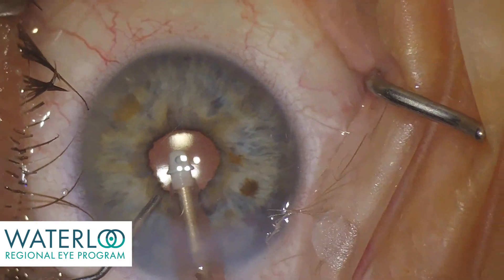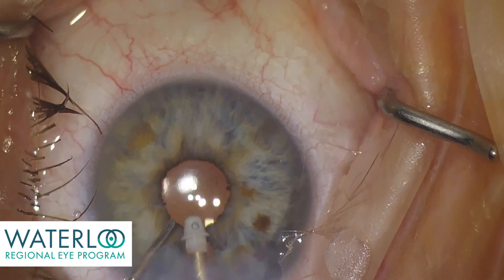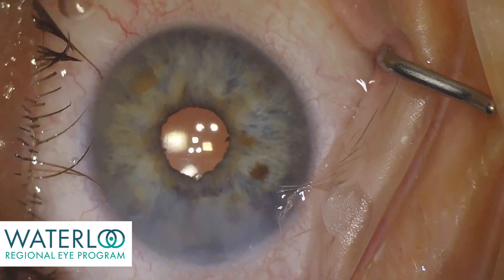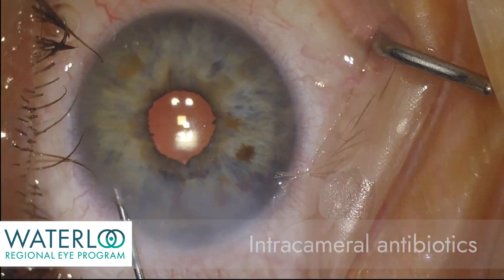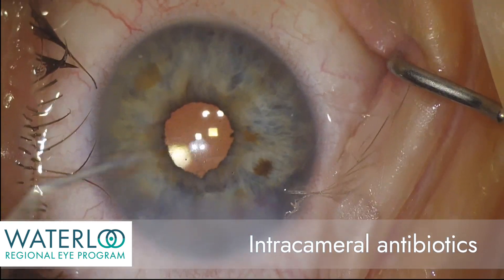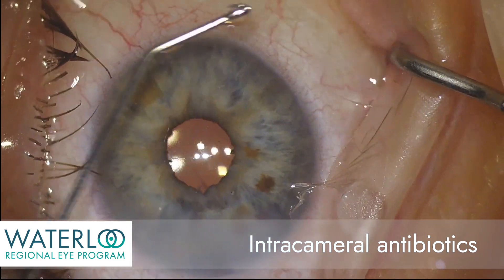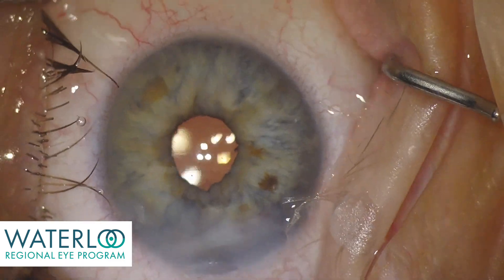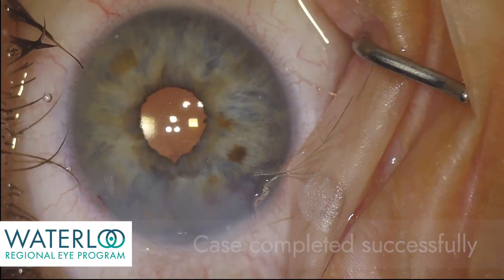The eye handpiece is removed, keeping the eye pressurized. Antibiotics can be injected intracamerally at the end of the case. The wounds are well sealed, the eye is nicely pressurized, and the case is completed successfully.